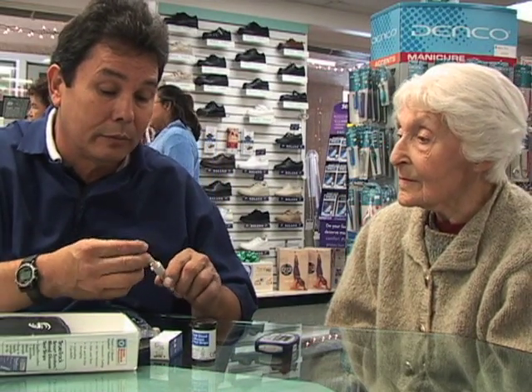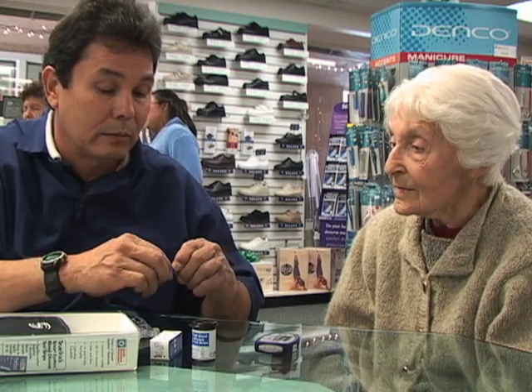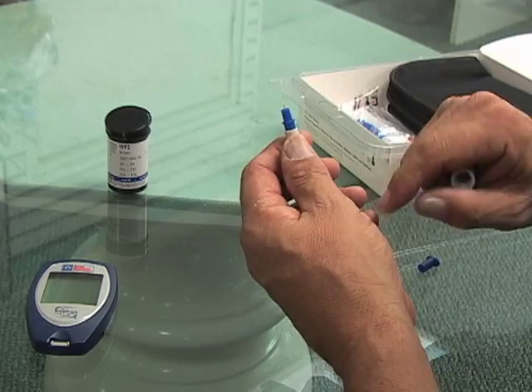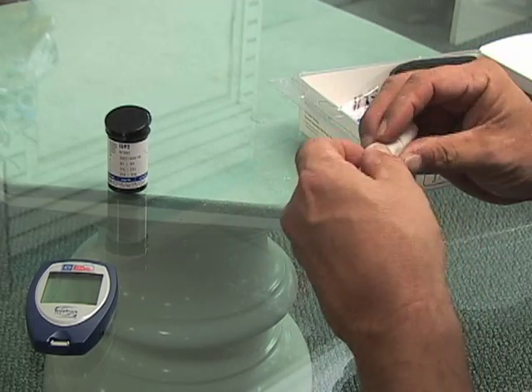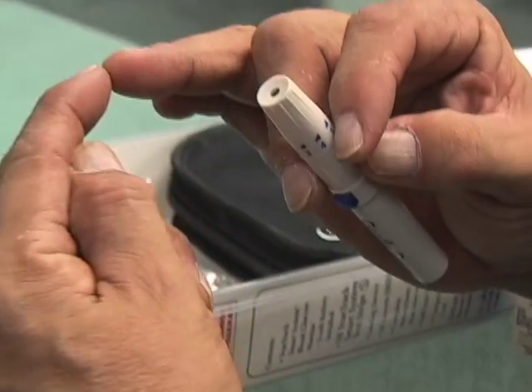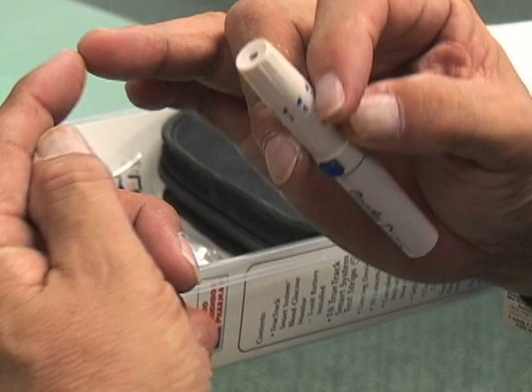Next, he shows her how to use the lancets. He places a lancet into the device and instructs Mrs. Nelson on its use. He makes the hole in the finger and reviews with her which areas of the fingers she would use to obtain a blood sample.